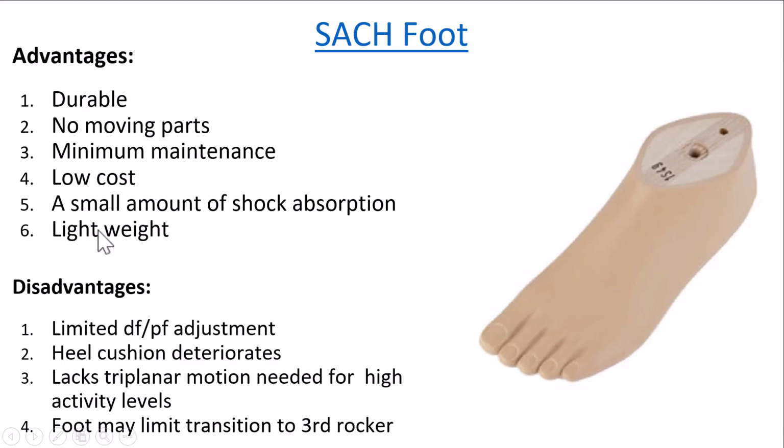Here is a picture of what the SACH foot looks like. Okay, it has advantages that are listed here, and there are also disadvantages that are listed here. I'd like to stop talking and have you watch this video of Dr. Ustall talking about a SACH foot.